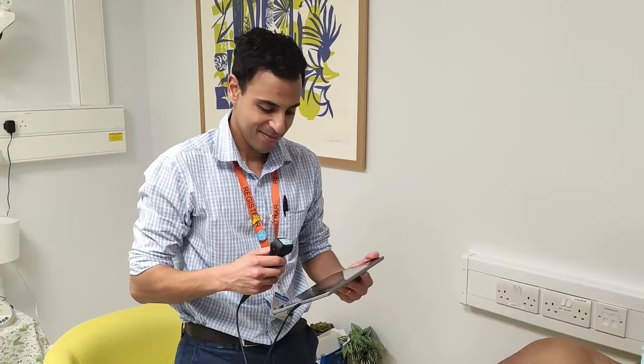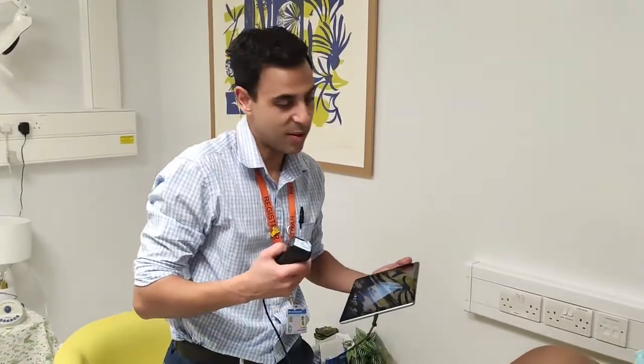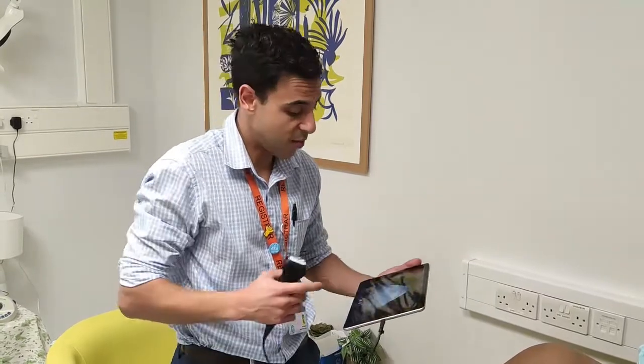So we've already seen how we can use the ultrasound to look at the lung, but Cam, just show us a bit more about how we might examine how the heart's functioning. So what we can do with the same probe is again examine the patient's heart and have a look just visually with our eyes without doing any fancy measurements. Does it look overall okay, or does it look really impaired?